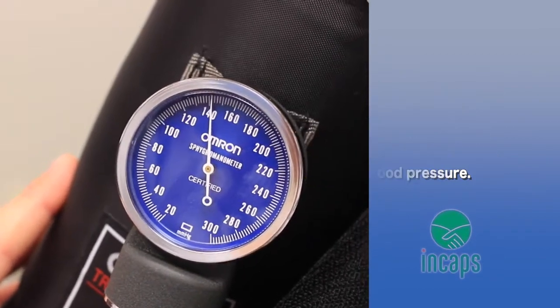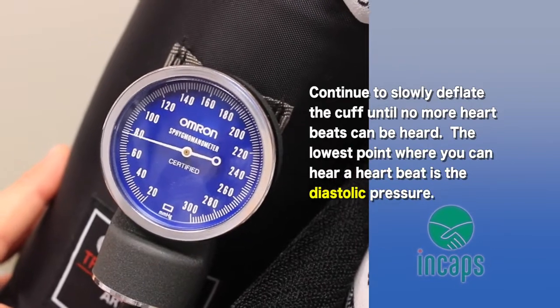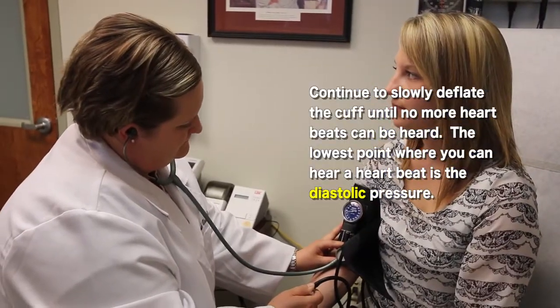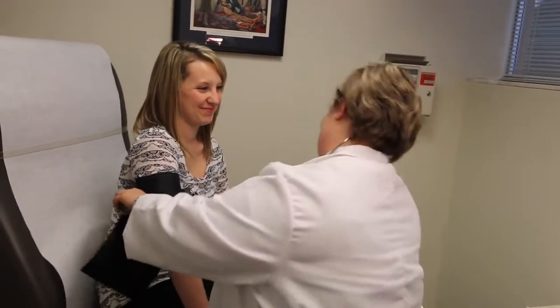We continue to gradually decrease the pressure in the cuff, still listening for each heartbeat, until we cannot hear a heartbeat again. Once we lose the heartbeat, that's going to be our diastolic blood pressure — the blood pressure when the heart is at rest. Those are the two numbers we listen for through the stethoscope while measuring blood pressure.